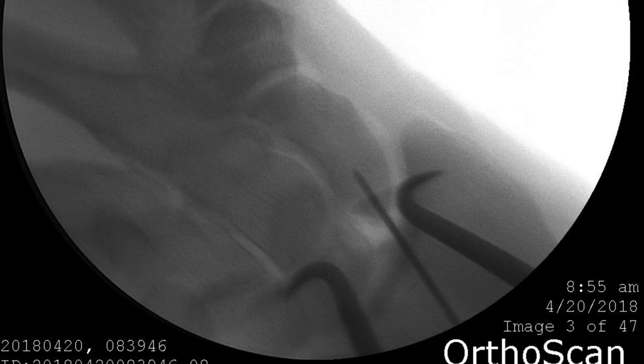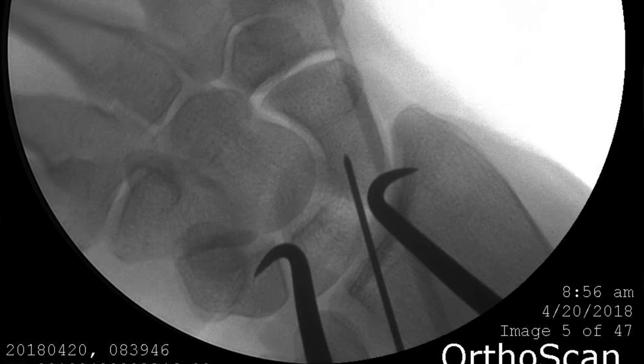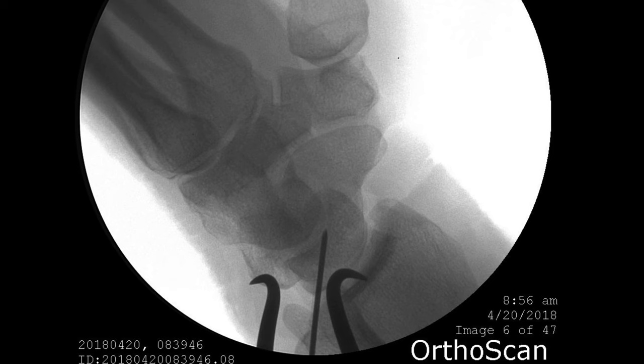So what I'm looking for here is that we started putting that wire in. The wrist was flexed a little bit, and I was aiming down the first metacarpal. This is what my aim was, and it's pretty parallel to my pin. Then on these images, I will dorsiflex the wrist a little bit and ulnarly deviate, because ideally I want to be in the central third of the scaphoid, and I think this is pretty close. Then I will roll slowly to a lateral, and I'm going to look where it's going to end up at that joint.